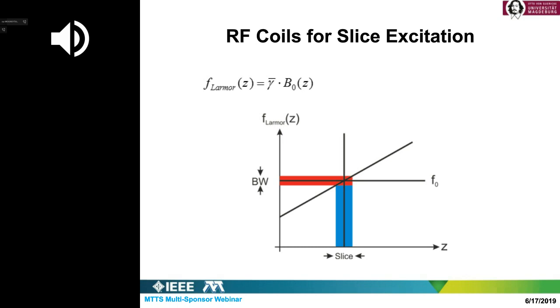The first step is to invert the population in a certain slice. Therefore, you apply a magnetic field. I have here the vertical axis in this view graph. It is a Larmor frequency which is proportional to the magnetic field, as you see in the first equation here. So if you create a ramp in the magnetic field, say along the z-axis, as you see here, now each section of the body along the z-axis corresponds to a specific Larmor frequency.